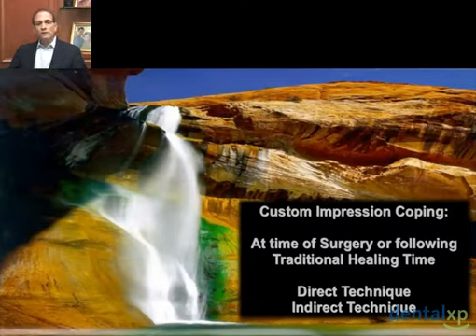The big question becomes, now that I've created this beautiful provisional that I want the laboratory to replicate with the exact contours, how do I communicate that to the laboratory? And the way we do that is with a custom fabricated impression coping.